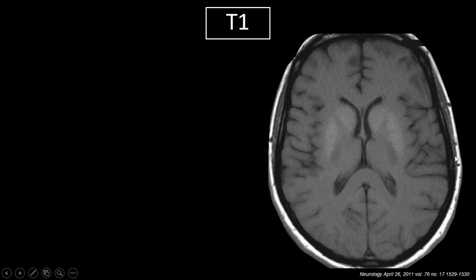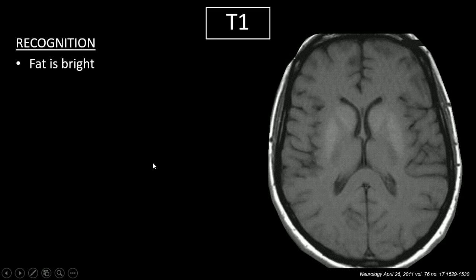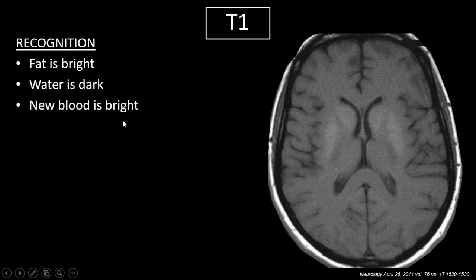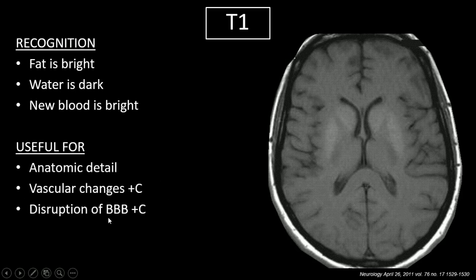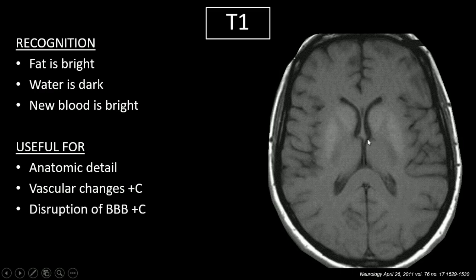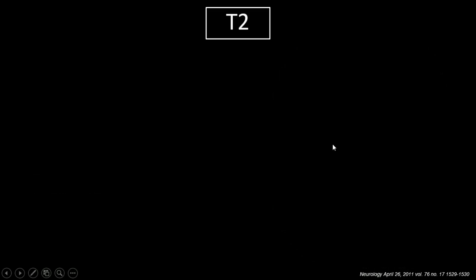Let's start with T1. How do we recognize T1? In T1, fat is bright, water is dark, and new blood is bright. This is useful for anatomic details. We can pick up vascular changes and disruption of the blood-brain barrier when we add in contrast. Looking at the image, CSF is dark and fat is bright. So areas where there's a lot of myelin — these deep white matter tracks — are going to show up bright, whereas the outer cortex is not.